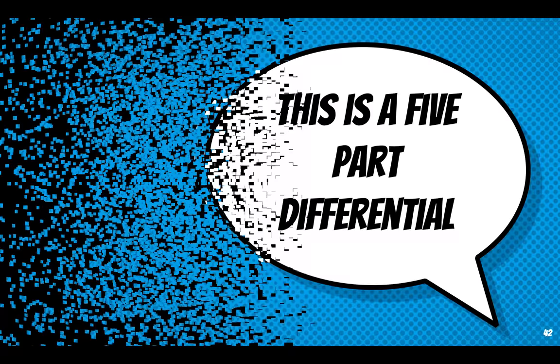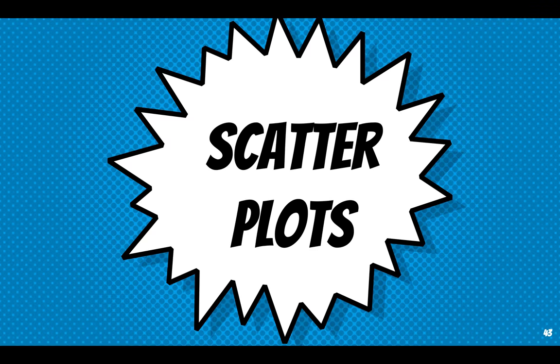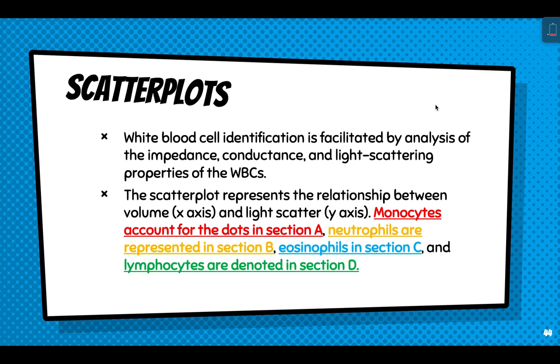We will now be using your five-part differential, and we are able to do that by scatterplots. Your scatterplots, on the other hand, are white blood cell identification. It's facilitated by analysis of electrical impedance, that is the principle of the machine, and light scattering properties of your WBC. So technically, what's going to happen is that your scatter plot represents the relationship between volume and your light scattering, which is your y-axis, okay?